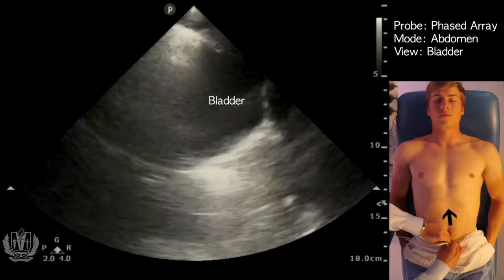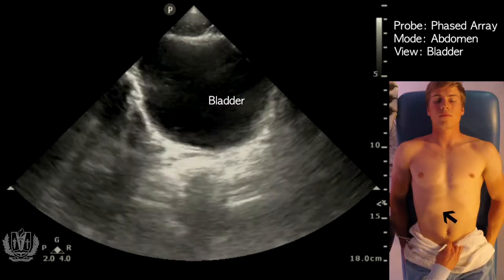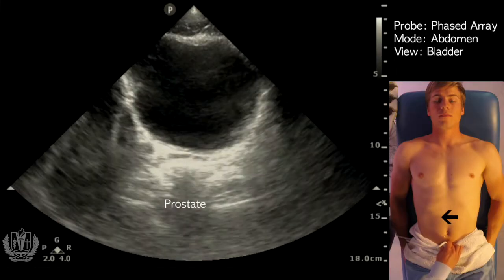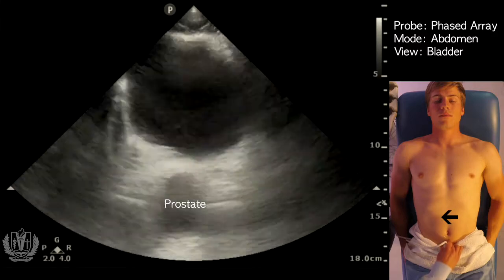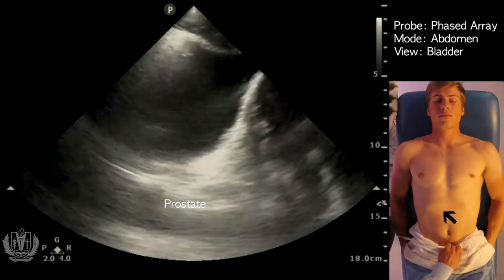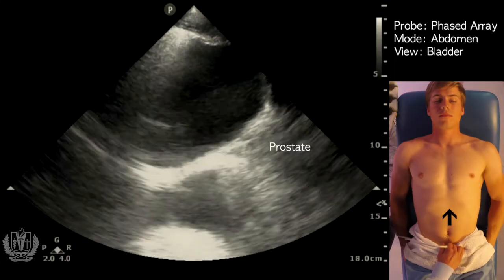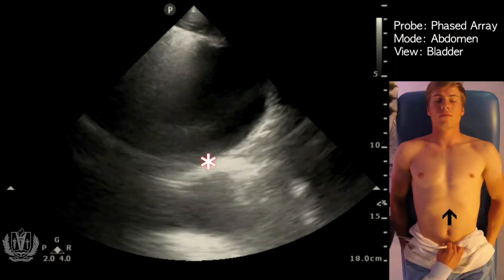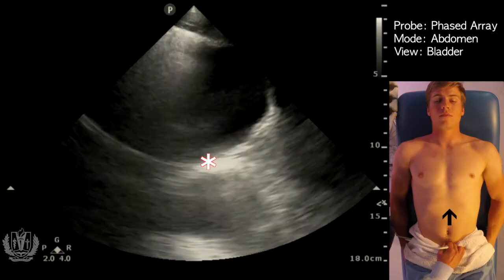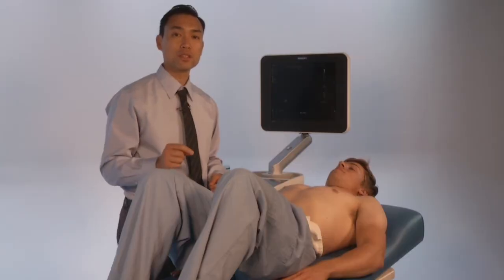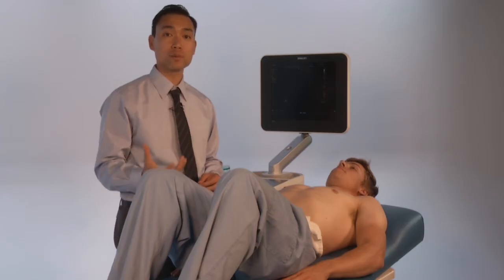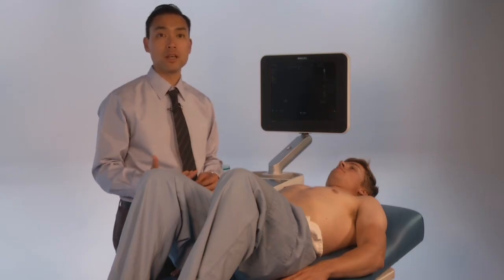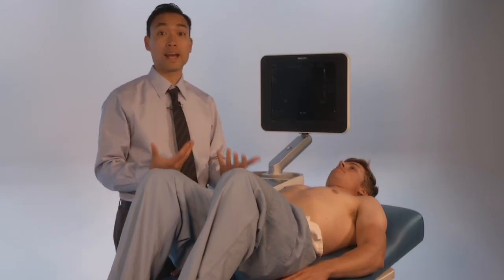You can also go to a transverse view to get another image of the bladder. Directly posterior to the bladder is the prostate, which you can see in both the transverse and sagittal views. Free fluid in this region would track just above the bladder and the prostate. Other things you can look for on pelvic ultrasound include prostate enlargement, post-void residual in patients with urinary retention, and bladder volume size before cathing a patient.